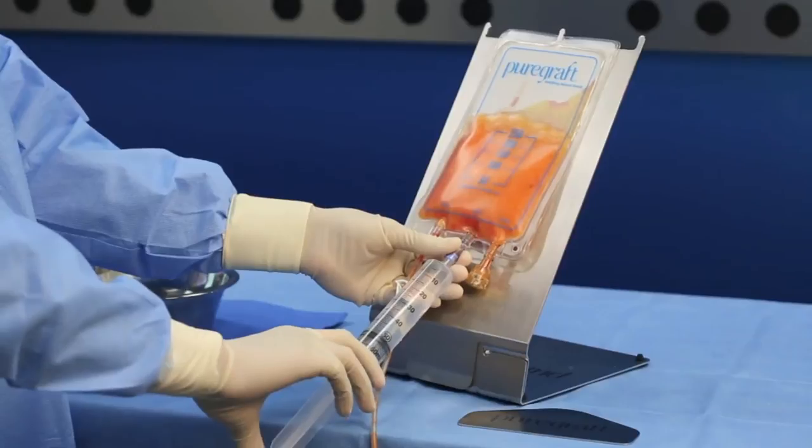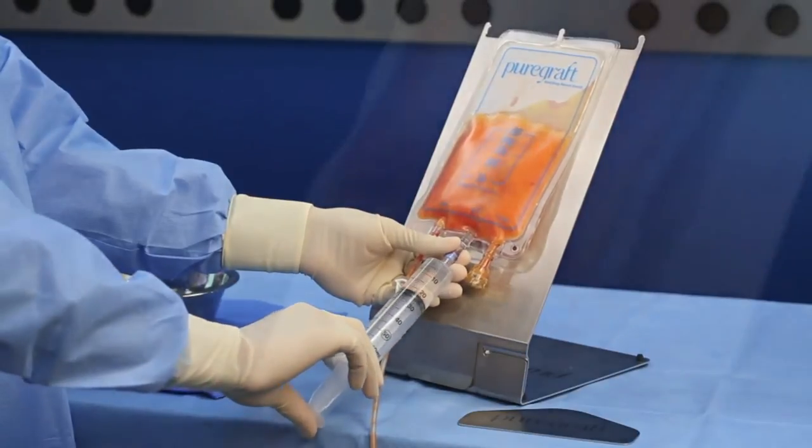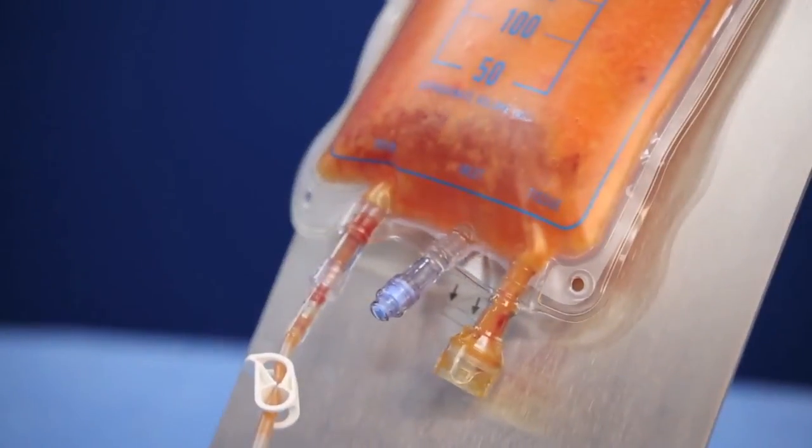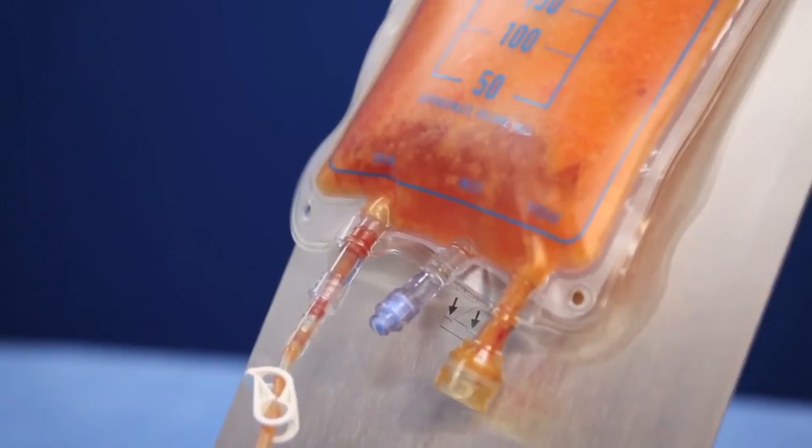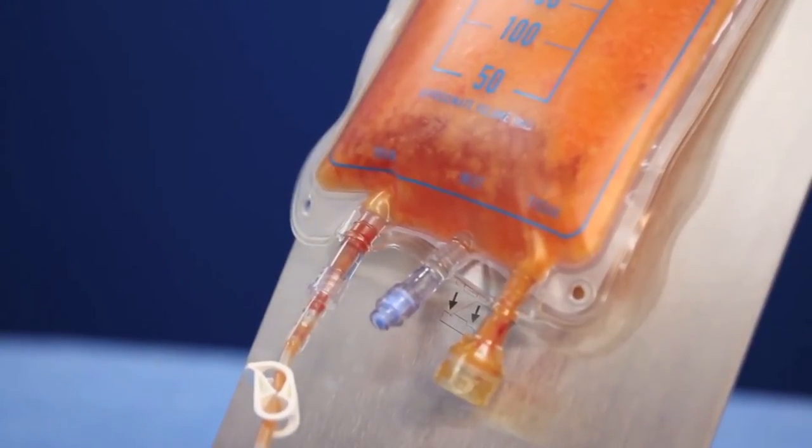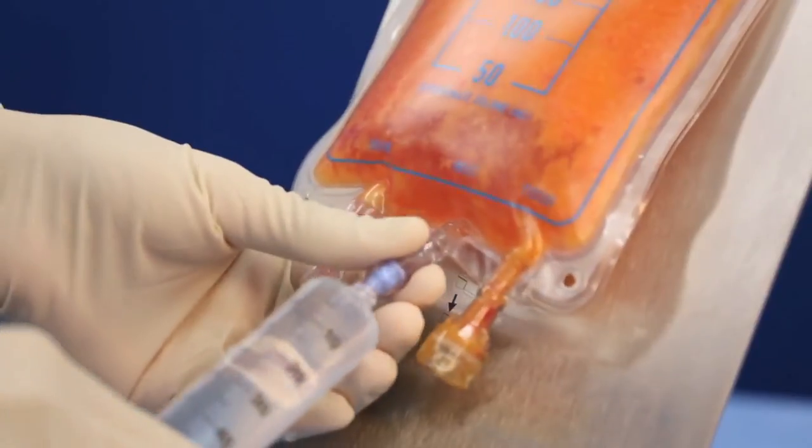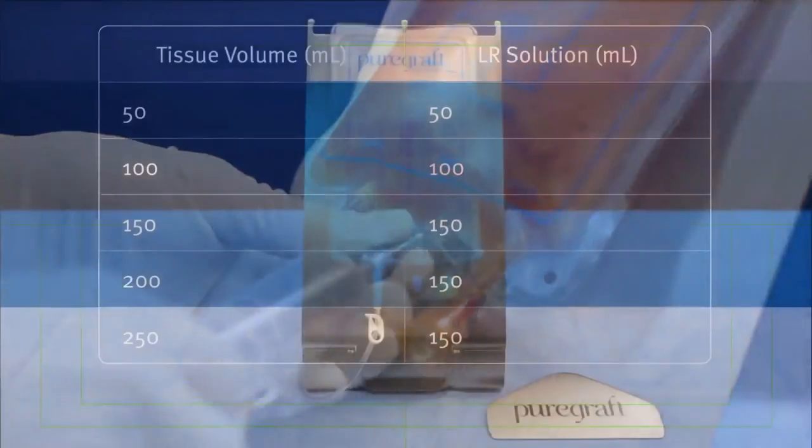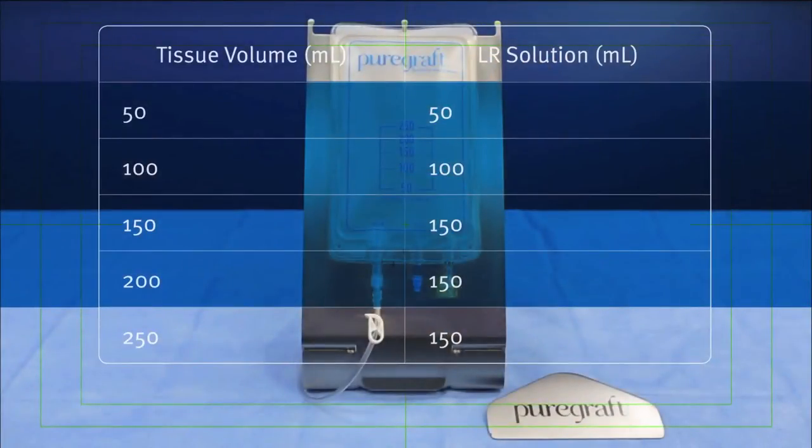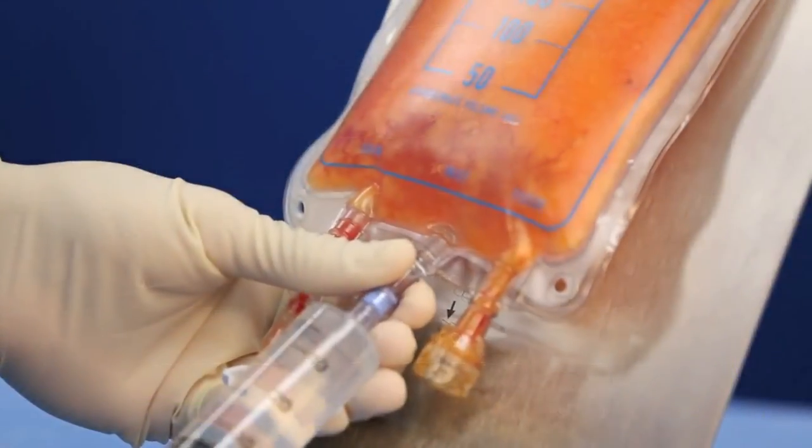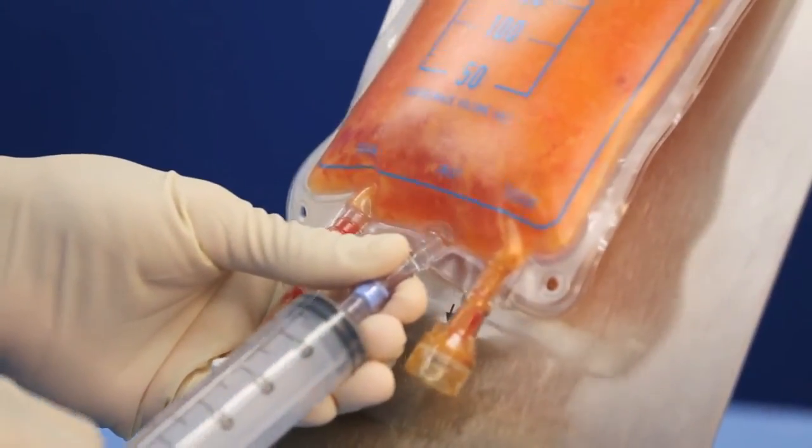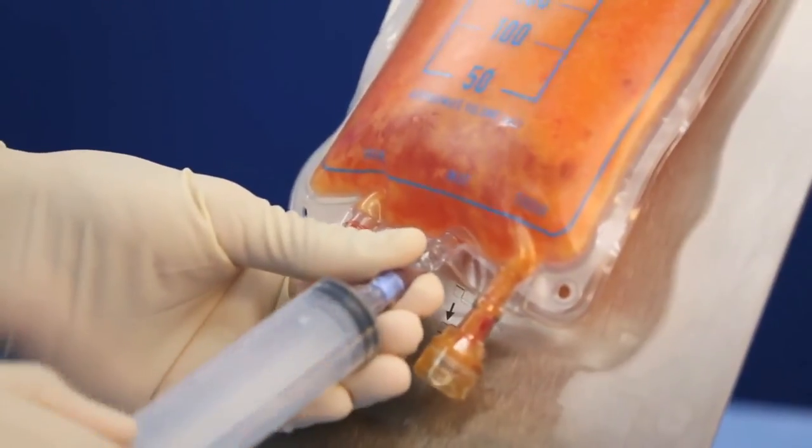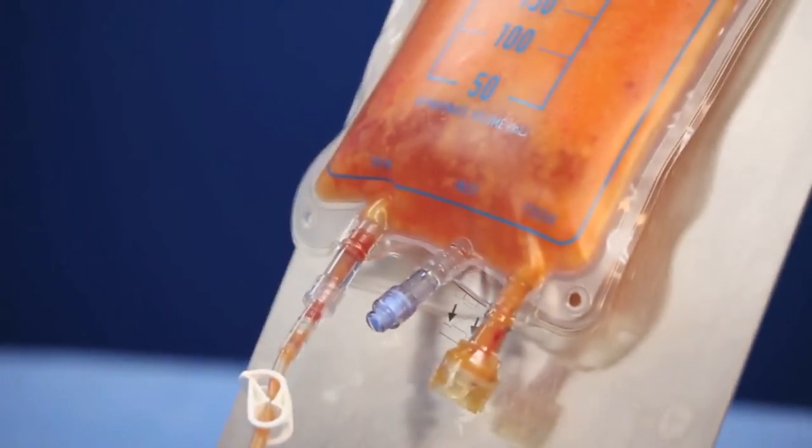Two wash cycles must be completed using lactated Ringer's solution irrespective of the method you choose. For the syringe method, empty the contents of the lactated Ringer's bag into a sterile container and aspirate lactated Ringer's into a 60 milliliter luer lock syringe. An approximate 1 to 1 ratio of lactated Ringer's to tissue should be used for graft volumes of up to 150 milliliters. Use 150 milliliters of lactated Ringer's for all larger tissue volumes.